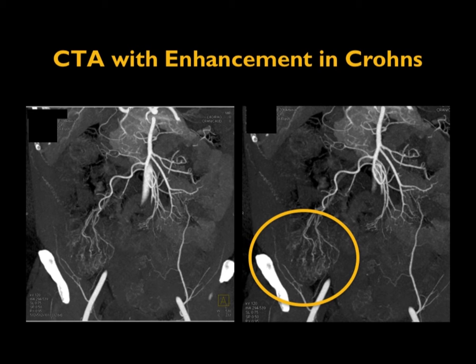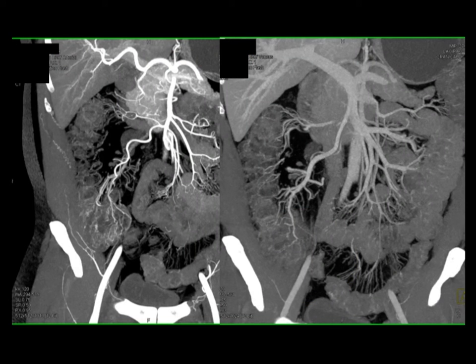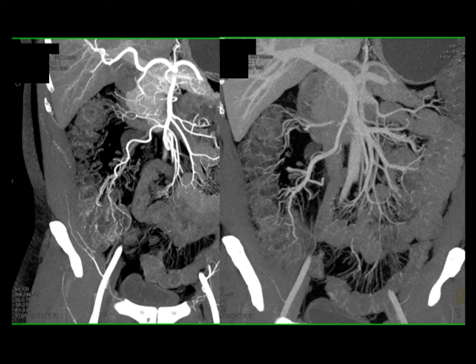Things you look for on CT enterography include mucosal hyperenhancement, wall thickening over 3 millimeters — typically in the 7 to 8 millimeter range — mural stratification (seeing bowel layers), prominent vasa recta (the comb sign), and mesenteric fat stranding. Here we see prominent vessels to the patient's right colon — this hyperemia is very classic for an inflammatory condition, in this case due to Crohn's disease. It's not neovascularity; it's prominent vessels and prominent flow. You can see increased flow in tumors with more neovascularity, but here it's very symmetric — you're thinking of an inflammatory process.